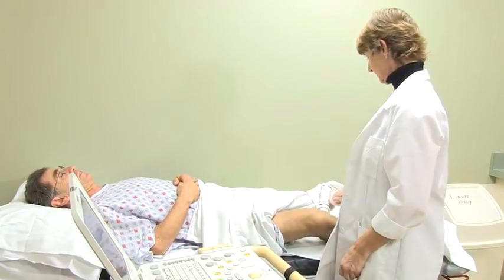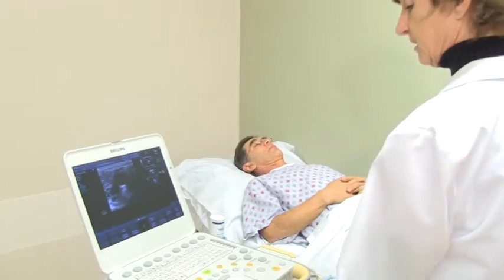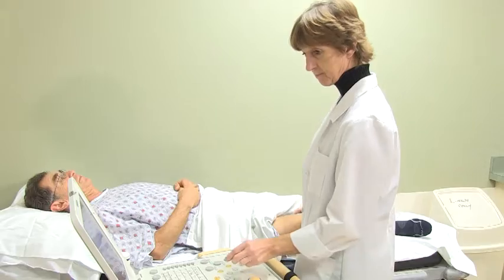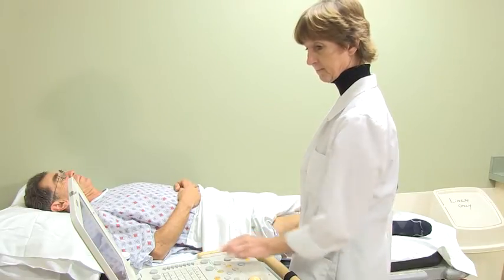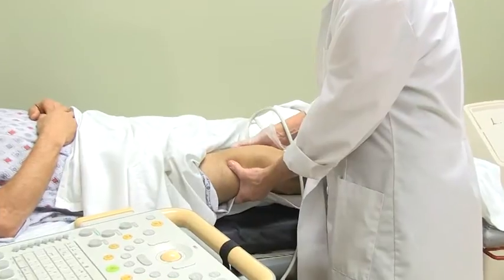The technologist will place a warm water-based gel on your leg and begin scanning your leg from the groin to the ankle. You will hear swishing noises at times, and at other times the technologist will press gently on your leg.